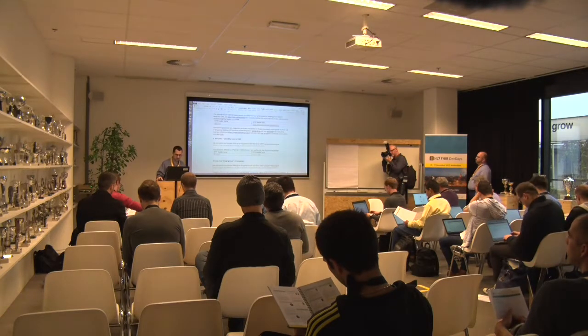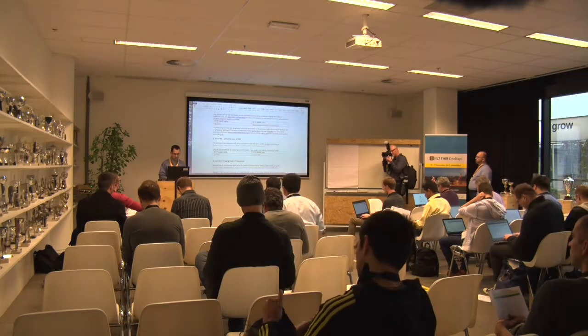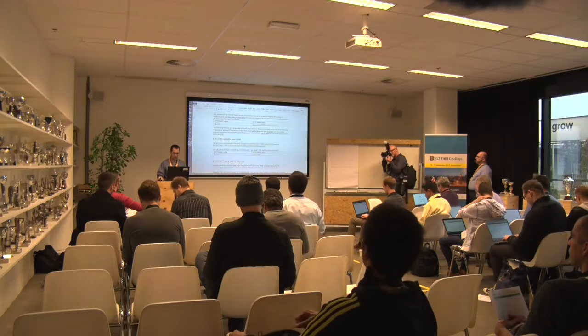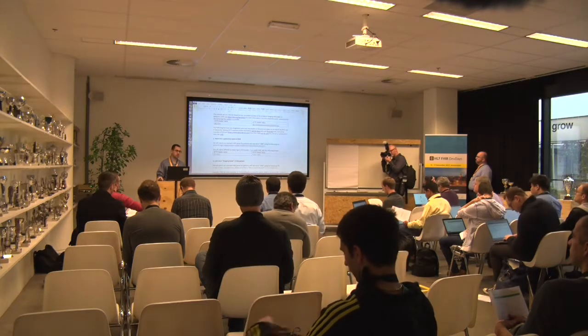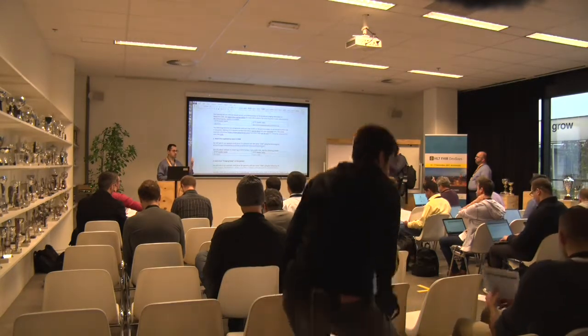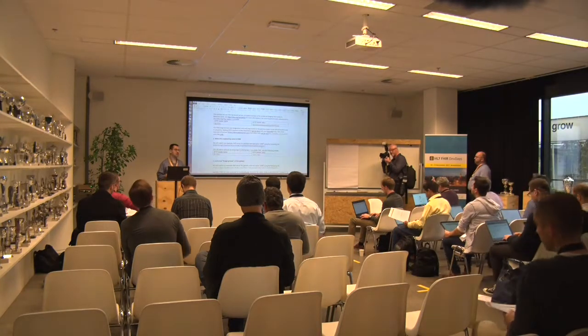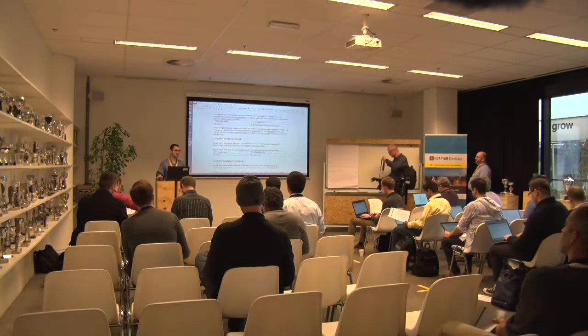All right, so let's get started. So the first thing we're going to do is we're going to try and find a patient by name, but in this case we're actually doing it by their ID, okay? So we have a patient here. We know their ID is called Genereaux. Now, in real life, you probably will want to search by patient name using an example URL like Brad showed. That unfortunately isn't actually working on our server. That's one of the reasons we're doing ID.